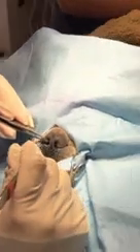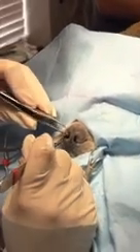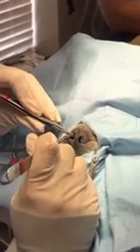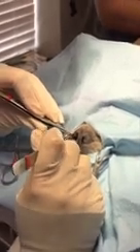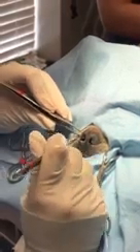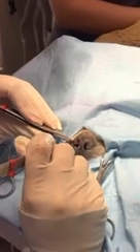The procedure is pretty straightforward — you just take a wedge out of this lateral cartilage here. You have to make sure you go deep enough. So we're going to start incising here into that cartilage and we're literally going to just take a wedge of tissue out of that fold.